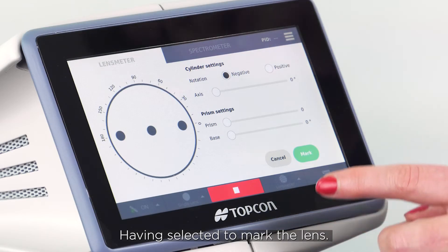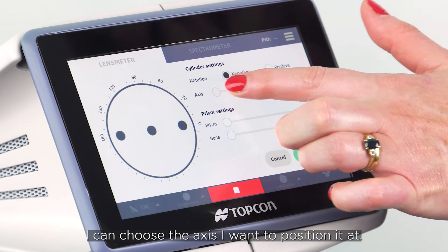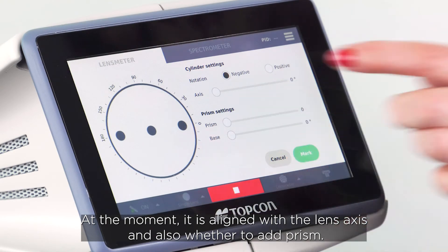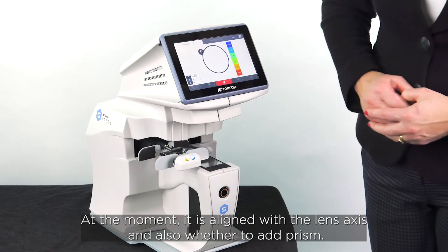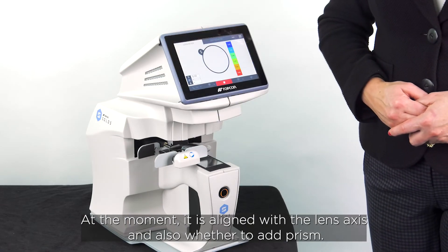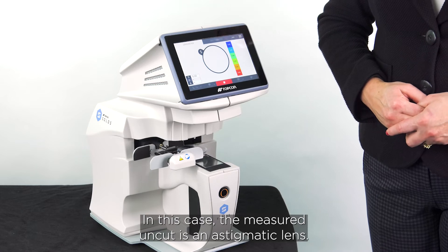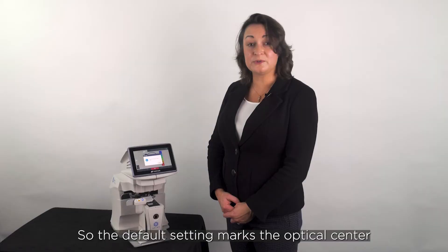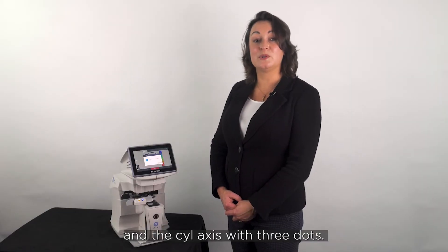Having selected to mark the lens, I can choose the axis I want to position it at — at the moment it is aligned with the lens axis — and also whether to add prism. In this case the measured uncut is an astigmatic lens, so the default setting marks the optical center and the cyl axis with three dots.